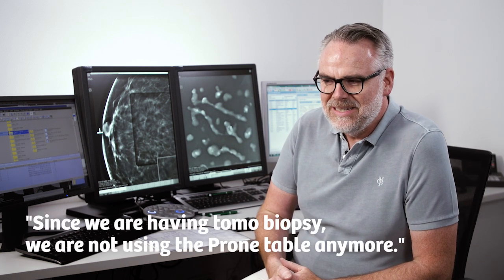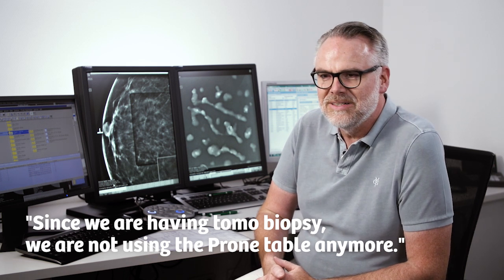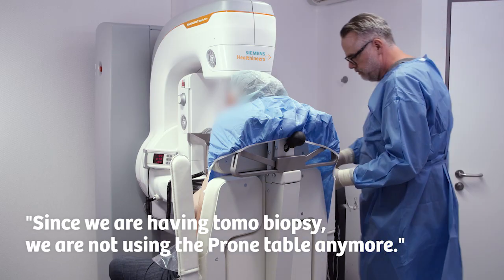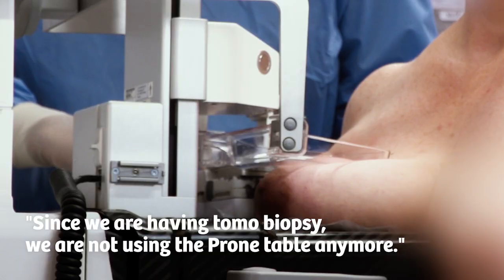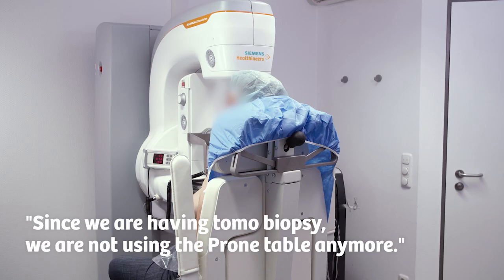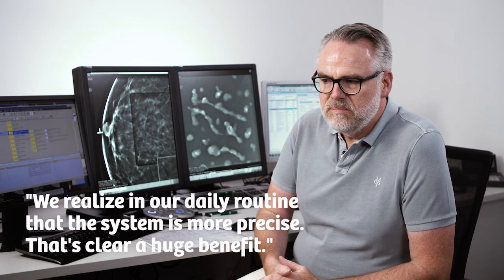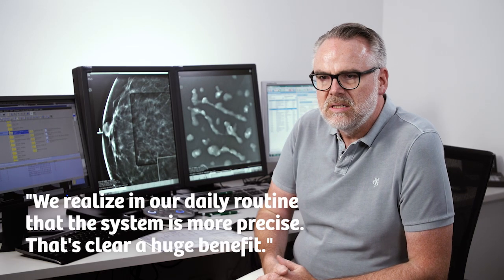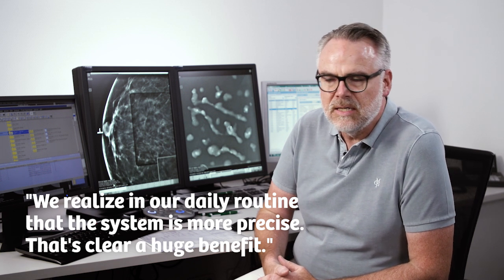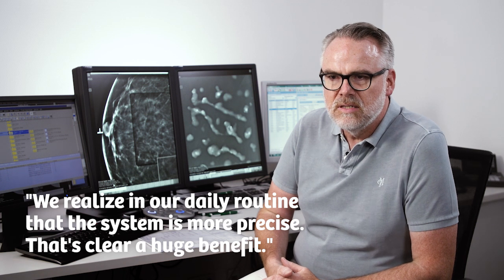But I must say that the ratio of biopsies performed on the prone table has significantly shifted in favor of tomosynthesis-guided biopsies. And that's ultimately due to the easy handling of the equipment. Above all, the precision and accuracy with which we perform the procedures is an absolute advantage. This really makes a noticeable difference in the daily routine.